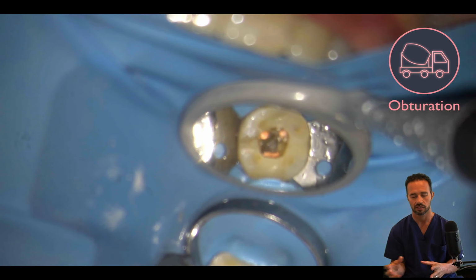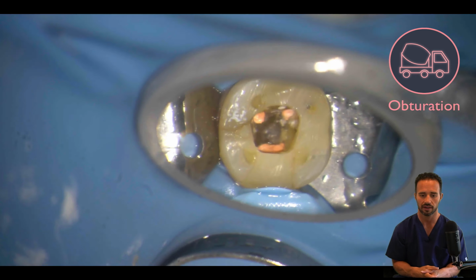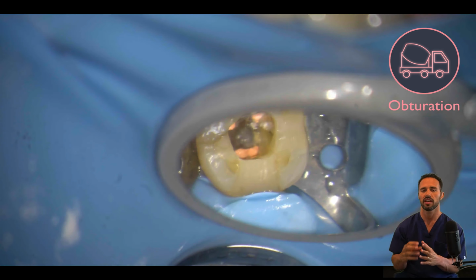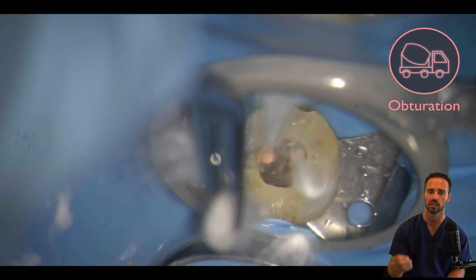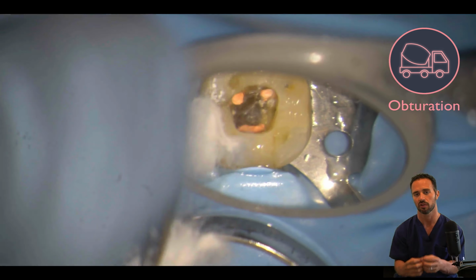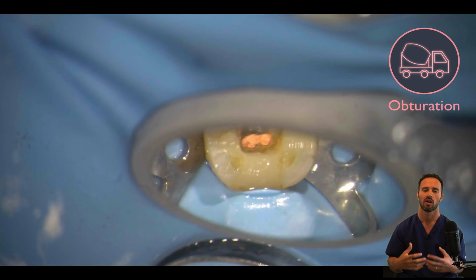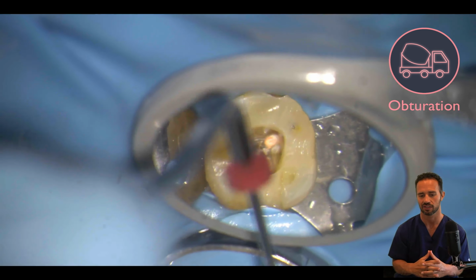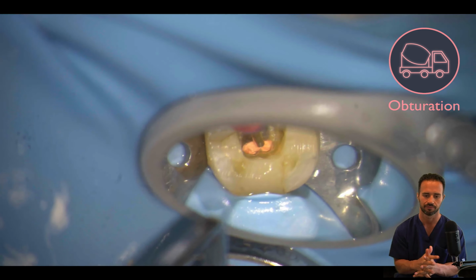If you want to go ahead and start a crown preparation because you have time, by all means go ahead and do that, but the point is you have the flexibility, and I want you to be time efficient so you can really power up your endo game, power up your revenues, and just enjoy all the benefits that endodontics has to offer. And so I'm just finishing touches here.